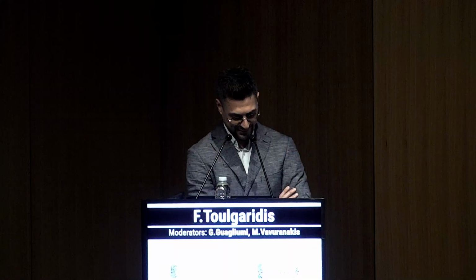Super. We saw that you were in trouble with the calcification. Going back and show what was going on, and then we are. Okay, thank you.